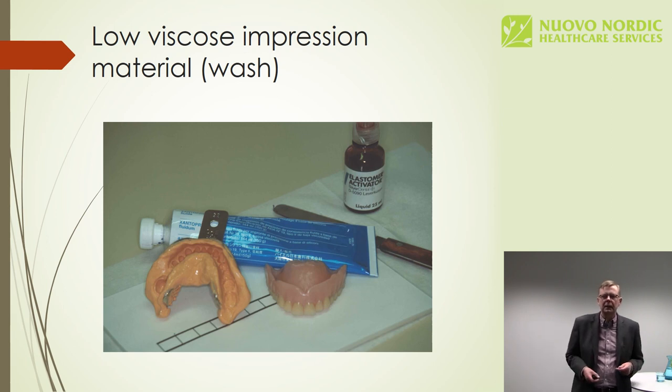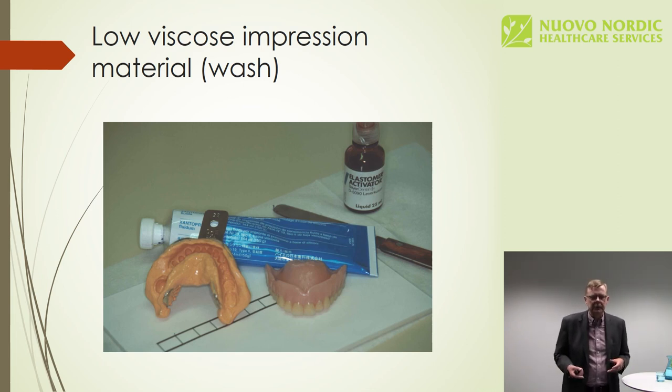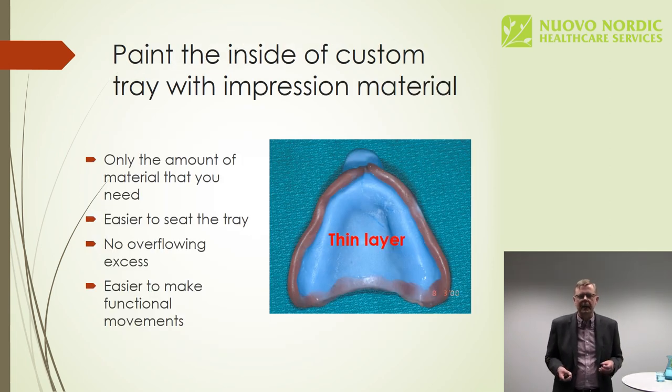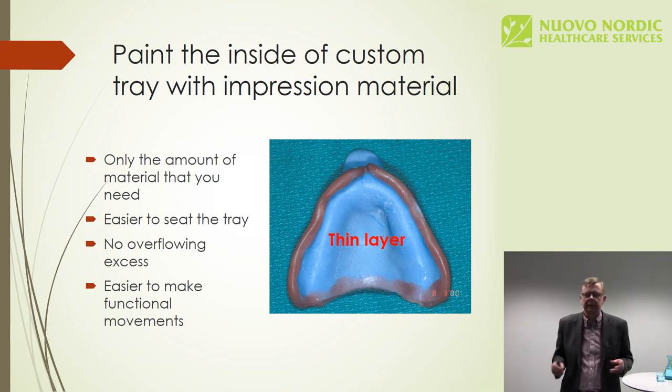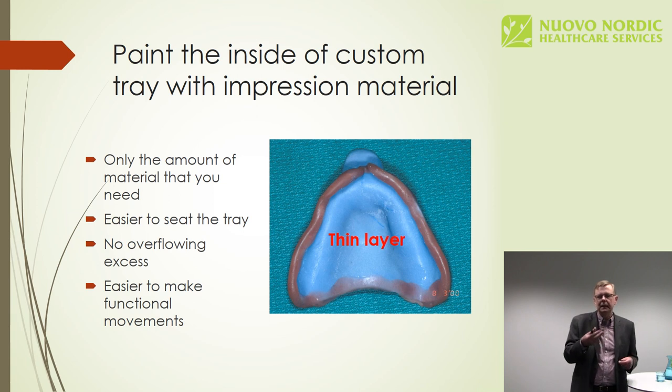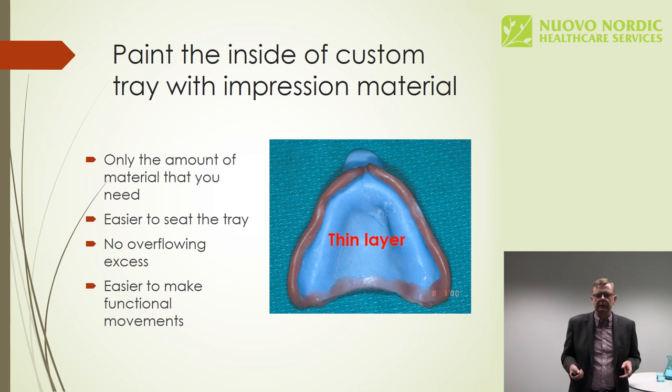Anyway, with the wash, we most likely will have the easiest way to seat the tray in the mouth. And now, this is important, remember that you only paint the inside of the impression tray with a thin layer of the material, because it definitely will be much easier to seat the tray in the same position where you border molded the tray, and also there will be less excesses flowing backwards.